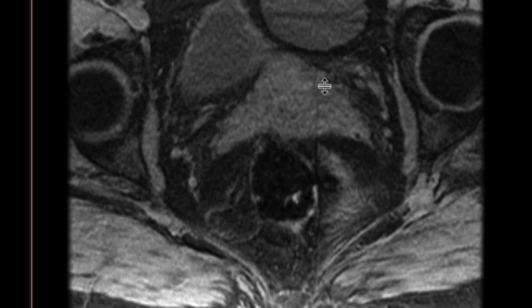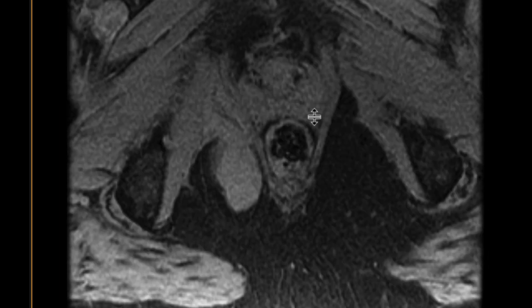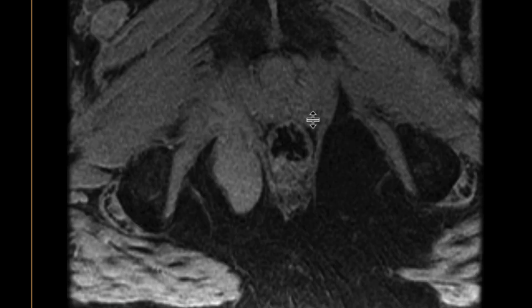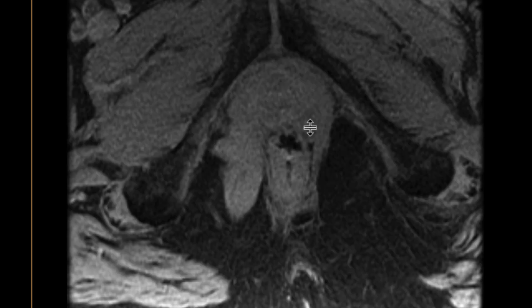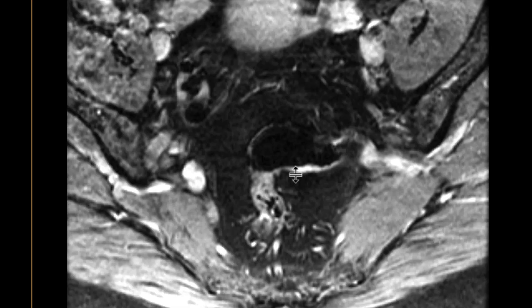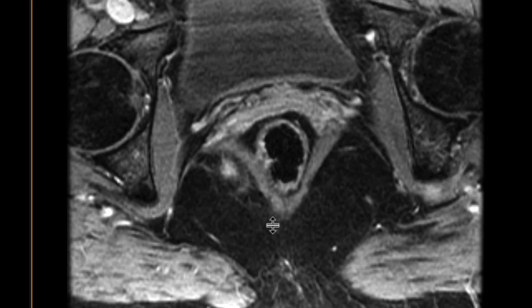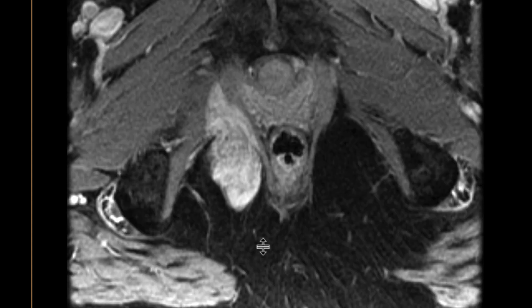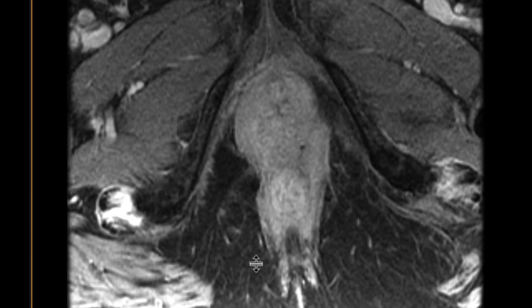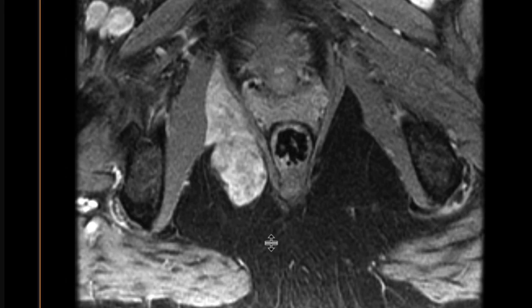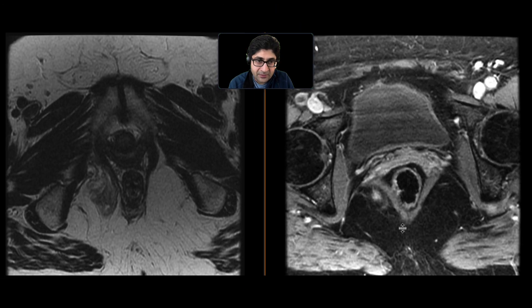Pre-contrast, we can see that it has sort of similar signal to muscle, maybe a little bit brighter. But post-contrast, we notice that there is very, very avid enhancement associated with this.